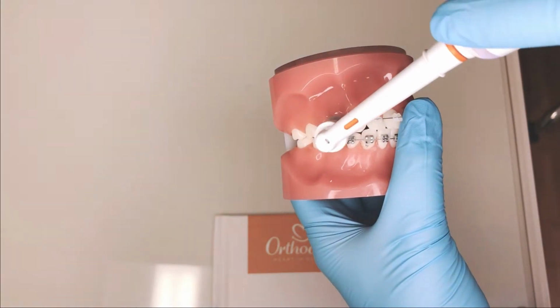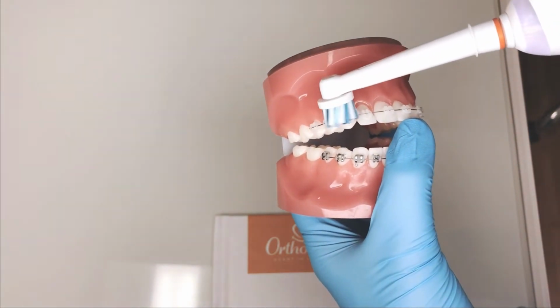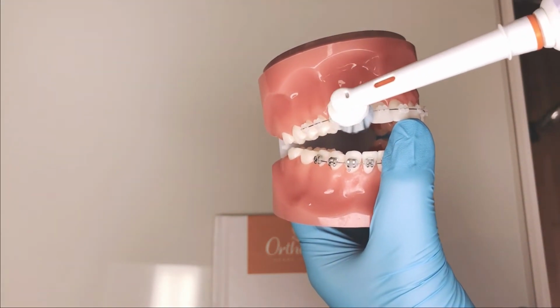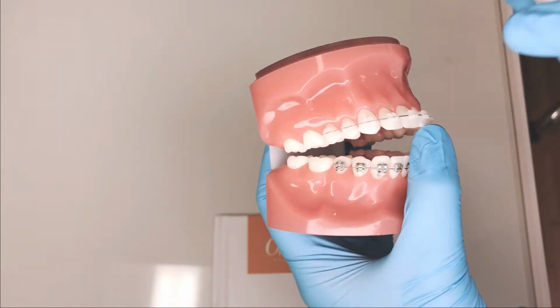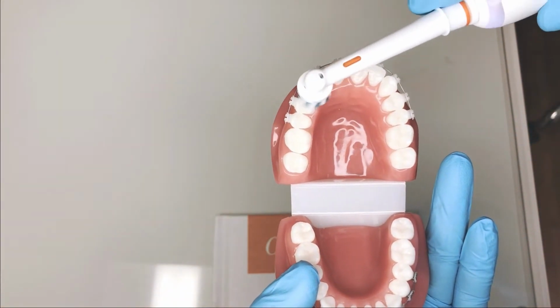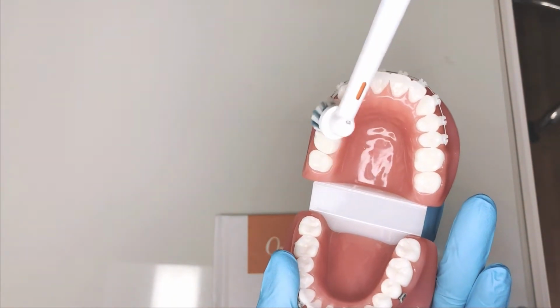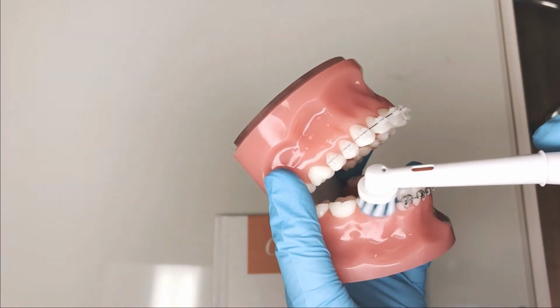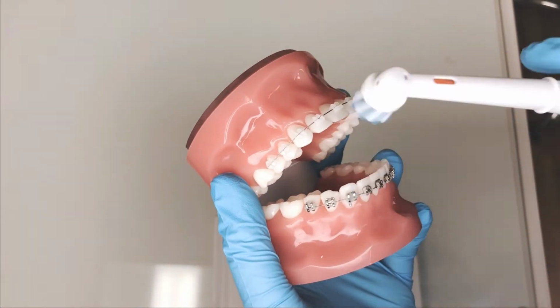Start from the area between the braces and the gums, and then move it down to cover the area between braces and the bottom part of your teeth. Move slowly enough to allow the brush head to do its job. Take your time going from tooth to tooth, and be sure to cover all the surfaces. You will still brush for at least 2 to 3 minutes if done correctly.